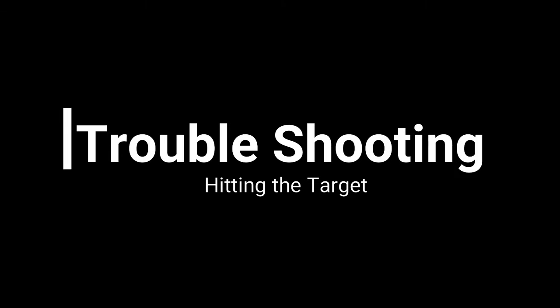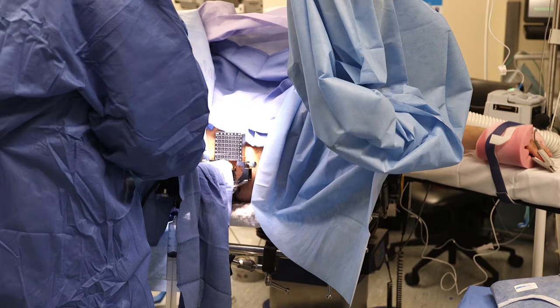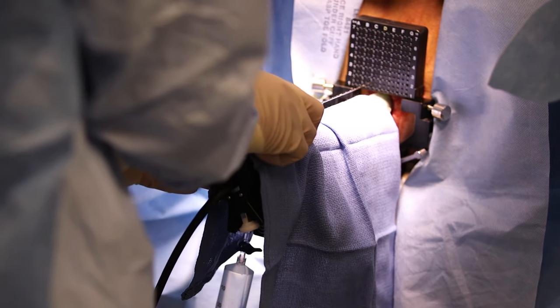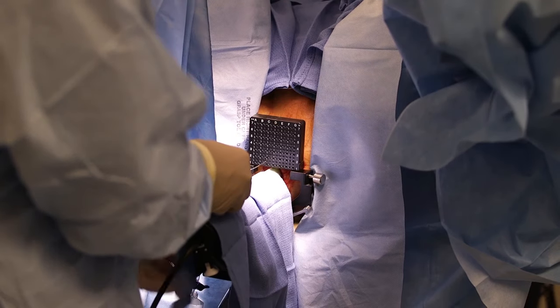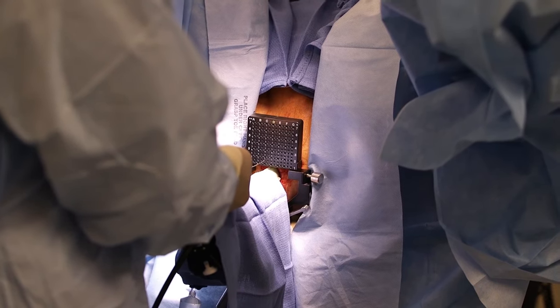Now that prostate visualization is optimized, we can discuss various techniques to obtain your desired target. The stepper holder fins can be moved on either side to alter the holes of the grid plate. We recommend visualizing the desired lesion on the ultrasound machine and then moving the fins to align the grid plate hole with the current view. The next technique is utilizing the biopsy gun bevel to change the direction of the biopsy. The biopsy follows the direction of the bevel. At the skin, the bevel should be down and then rotated upwards for posterior lesions to avoid the rectal wall and rotated medially for lateral lesions. The top of the grid plate can be pushed towards the patient to assist in bevel down and pulled away from the patient to assist in bevel up.